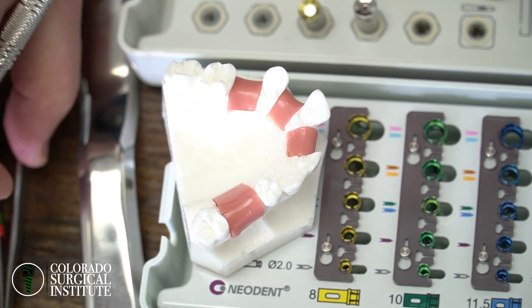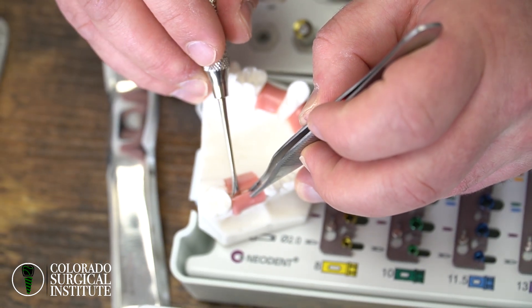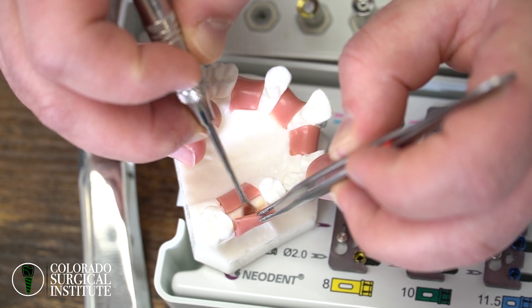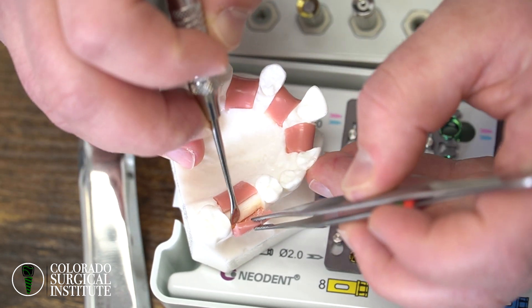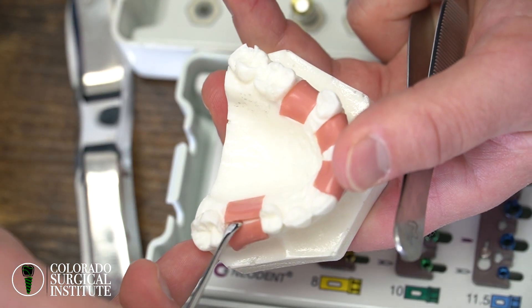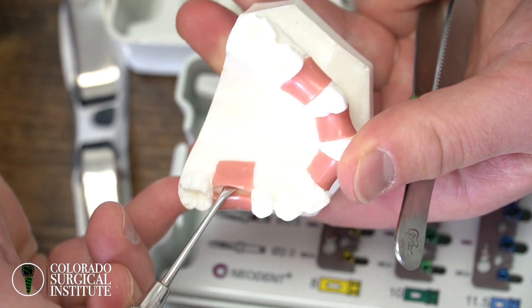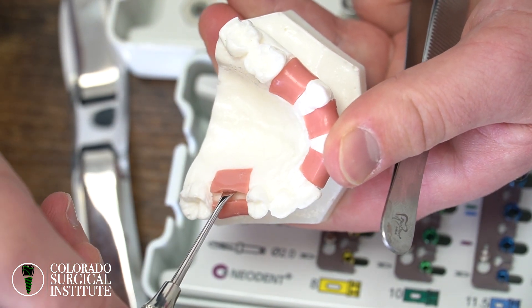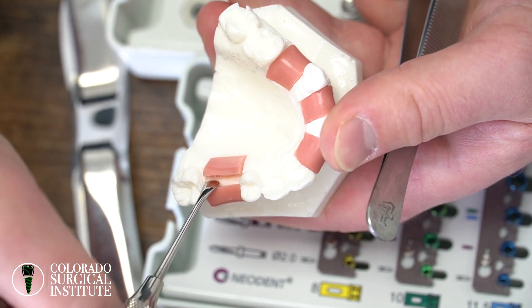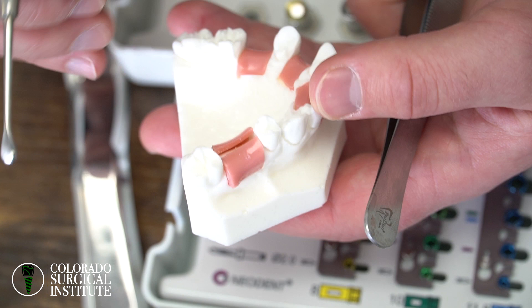On the lingual side, go back and forth and then lift the instrument up in the air — boom, it comes undone. It's not really a lot of motion: tuck the elevator underneath, lift straight up, and your lingual flap will be retracted. One thing I like to do is pick up the top of the tissue to get a good hold on it, then move the edges up while scraping off the periosteum. You end up with a nice clean flap.